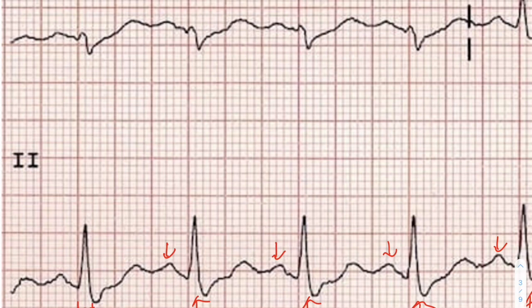Next we look at our PR interval, measured from the beginning of the P wave to the beginning of the QRS. The normal range is less than or equal to five small boxes, or less than 200 milliseconds. Counting our boxes — one, two, three, four, five — that gives us about five small boxes, so we have a nice normal PR interval.